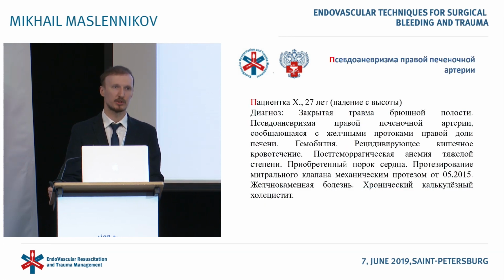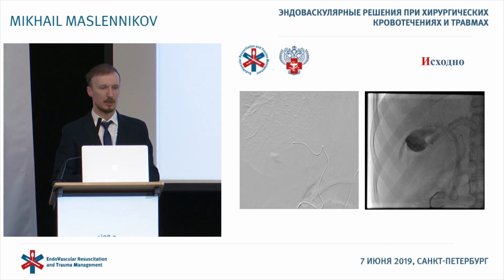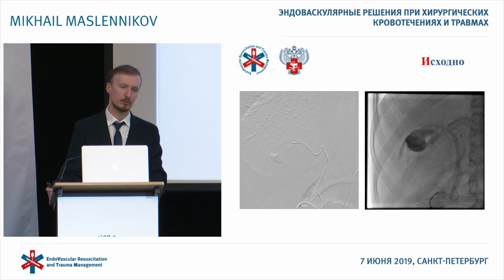Several clinical cases, as an example of our work, when vascular surgeons and traumatologists insisted on an initial endovascular procedure. A female, 27 years old, was admitted with closed abdominal trauma. She fell from height. What hindered our intervention?